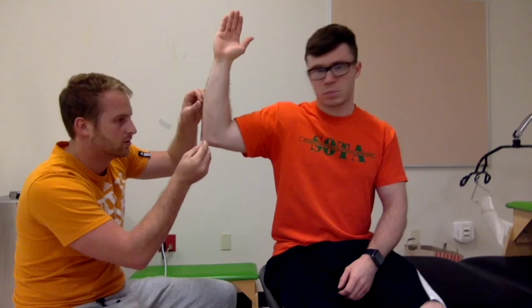External rotation, we're going to go to the olecranon process. We're going to keep both arms parallel to the forearm, and then go ahead and move. All right, we got 90 degrees.